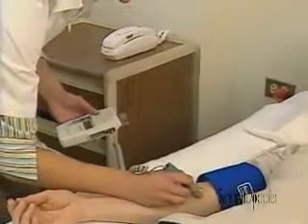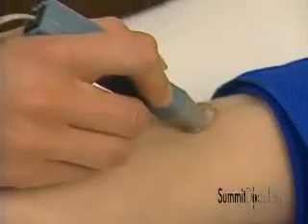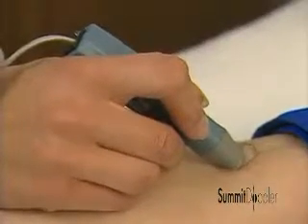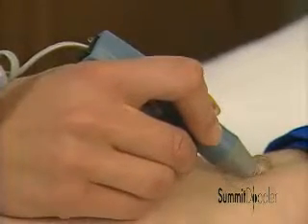Slowly move the probe laterally to find the arterial pulse. Make small adjustments to obtain the loudest arterial signal. Avoid pressing too hard, which could occlude the flow. Depending on the patient, you may hear some venous sounds alone or in the background while listening to an arterial signal.